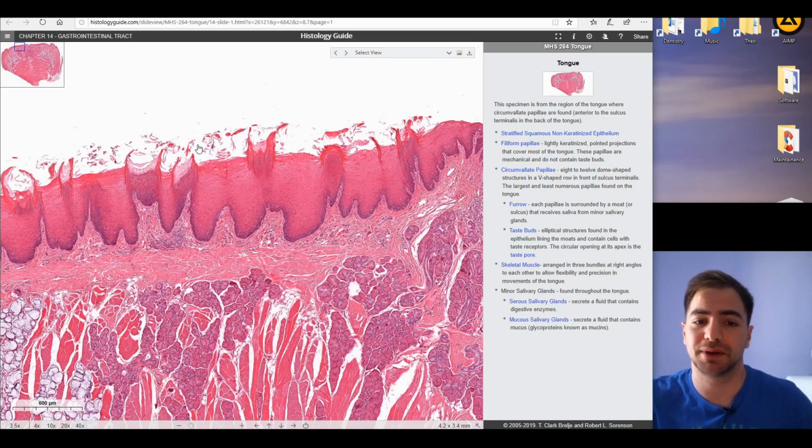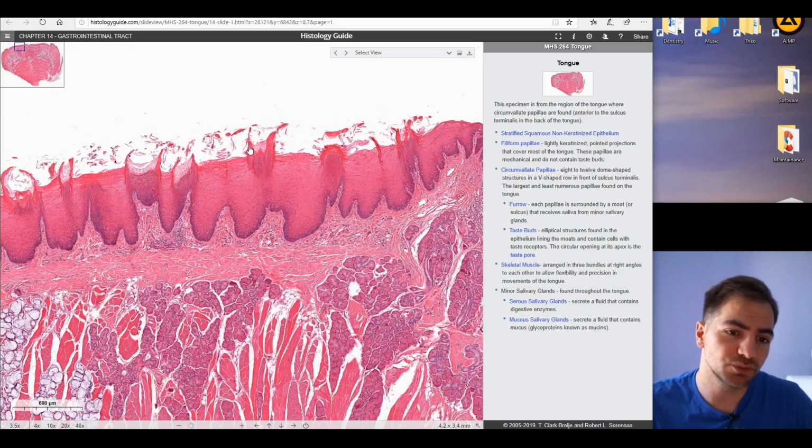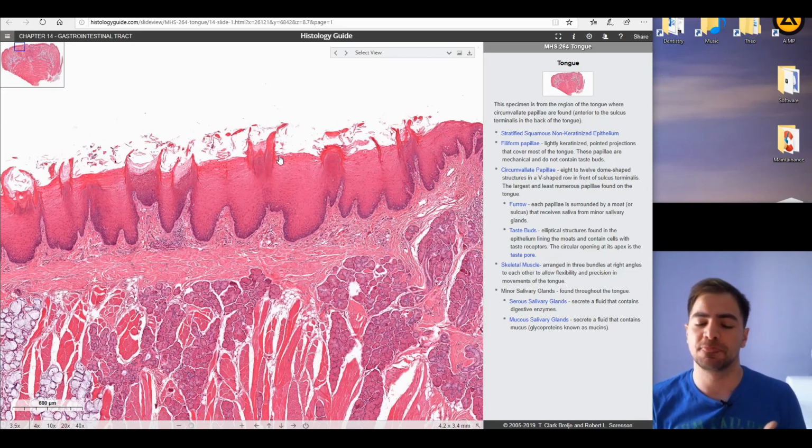Now, these structures are parakeratinized. Specific areas of the tongue are parakeratinized, and some are fully keratinized. Of course, it is easy to distinguish simply because if you look at the structure, you can see nuclei on the top. This is parakeratinized. If you don't, it's fully keratinized. So these projections, these projectile structures, are actually the filiform papillae. What's the function of the filiform papillae? Well, this is again a structure to resist abrasion and to, of course, be able to induce friction.